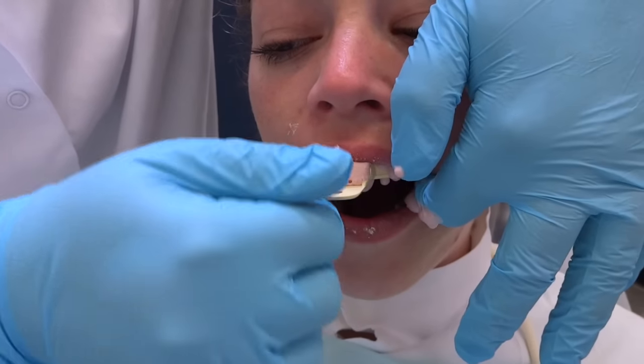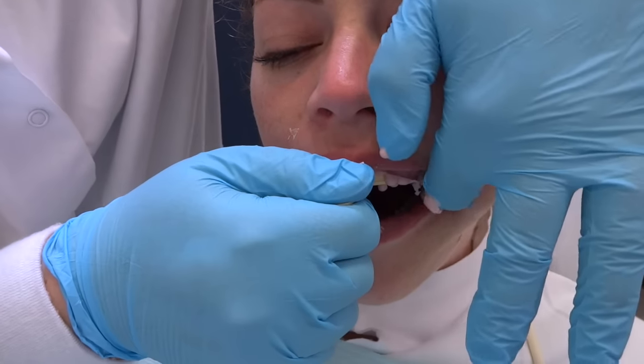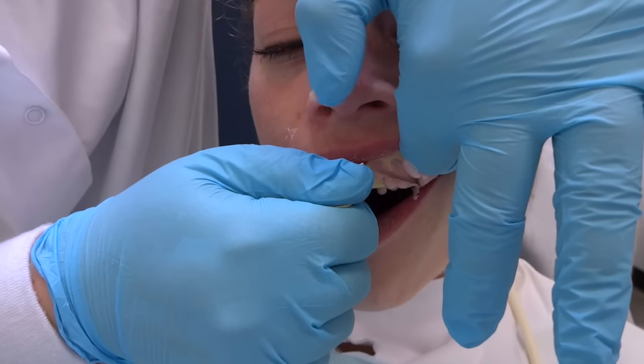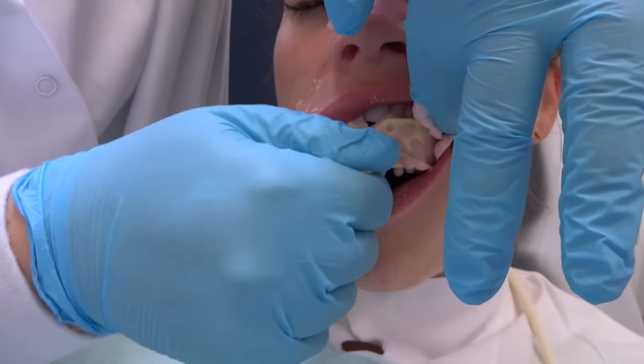When you take it out, try to have it come off all at one time, but sometimes that's impossible. So sometimes I'll reach my finger up into the buccal vestibule and kind of push down on the side and rock it out.